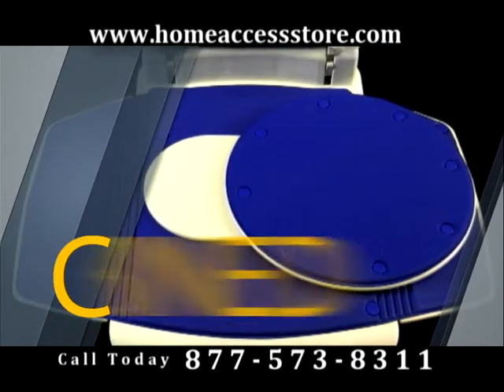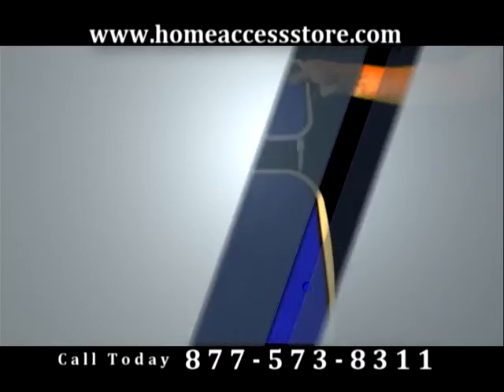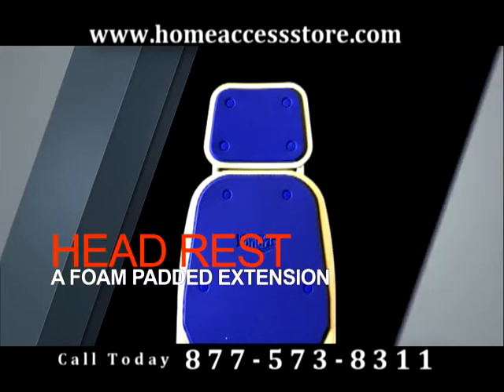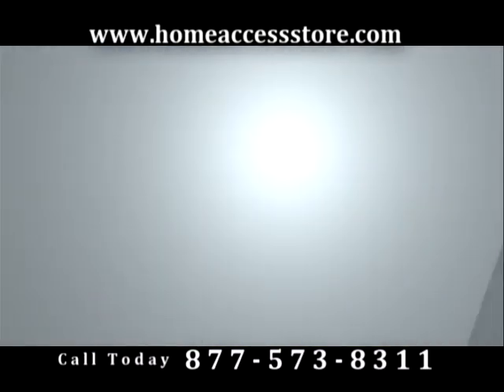This bath lift can combine with a swivel seat, providing an almost effortless transition in and out of your Cenaris Bath Lift. Also offered is a headrest, a foam padded extension for another layer of comfort and a more pleasant experience, all while utilizing the capability of the Cenaris Bath Lift to recline a full and relaxing 40 degrees.